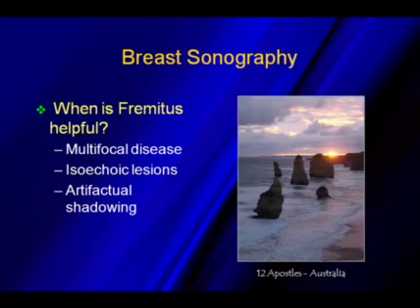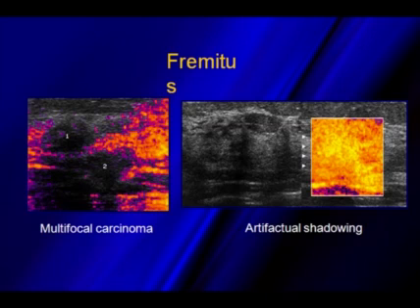So where do we find fremitus helpful? When we look for multifocal disease, when we are trying to evaluate isoechoic lesions, and also with artifactual shadowing. It's not something that I use every day on every single patient that we scan, but there are certain cases that we find it can be very helpful with.